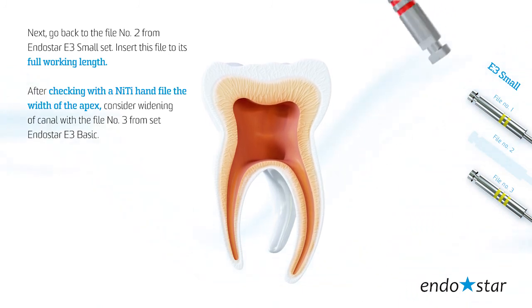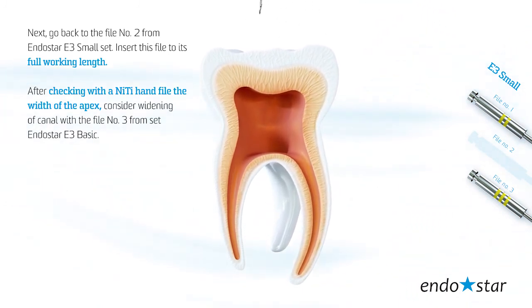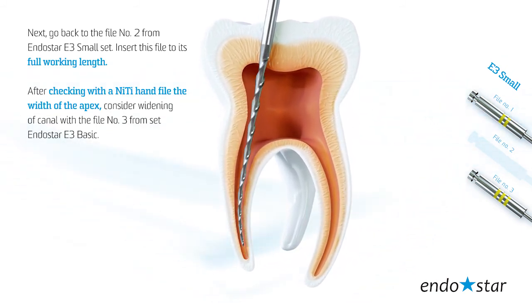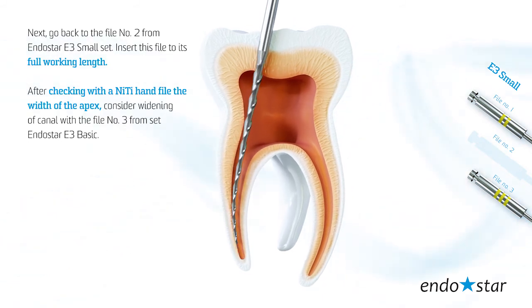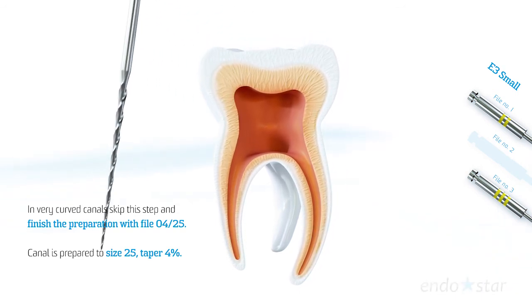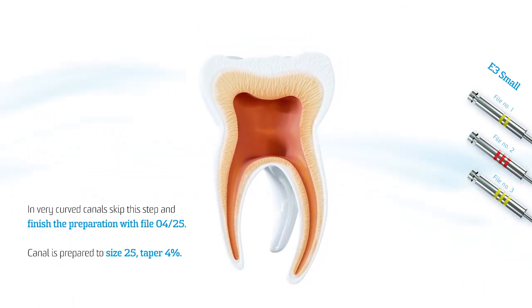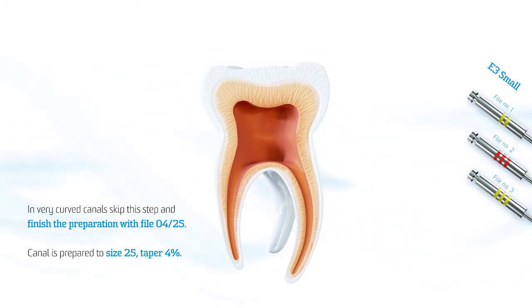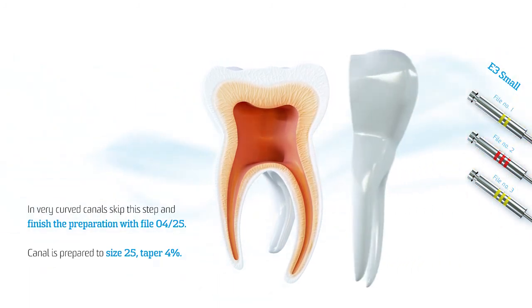Insert file number 2 to its full working length. After checking the width of the apex with the nickel-titanium hand file, consider widening the canal with file number 3 from the Endostar E3 Basic set. In very curved canals, skip this step and finish the preparation with file size 25 taper 4. The canal is prepared to size 25 taper 4.